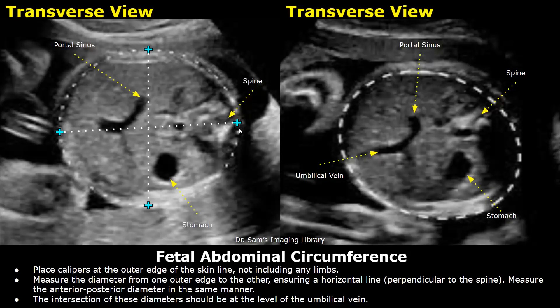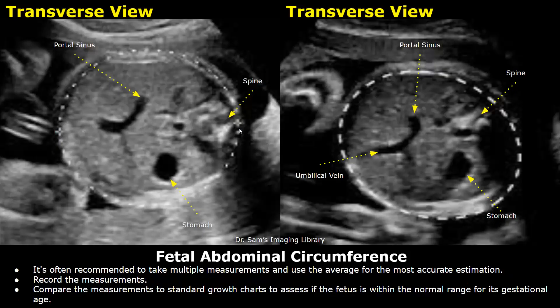It is often recommended to take multiple measurements and use the average for the most accurate estimation. Record the measurements and then compare them to standard growth charts to assess if the fetus is within normal range for its gestational age.